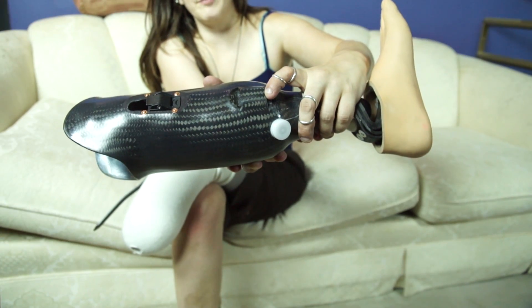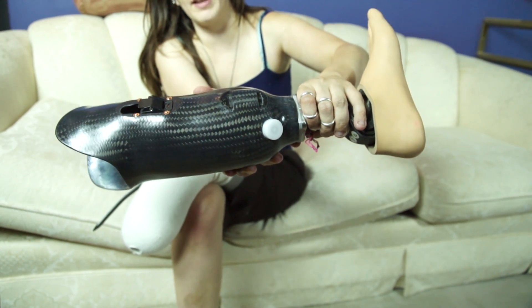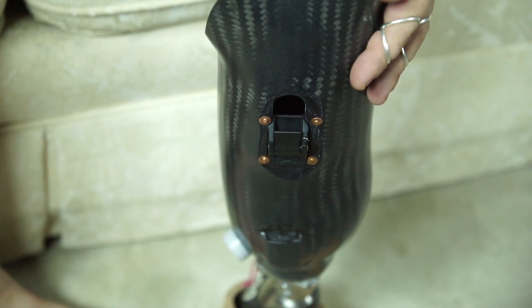My prosthetist even built me a special insert for the end of the ratchet strap, so that it's not flopping all over the place when I'm wearing my leg. This is a close-up shot of the ratchet strap, so you can see more clearly how the Proximal Lock works.